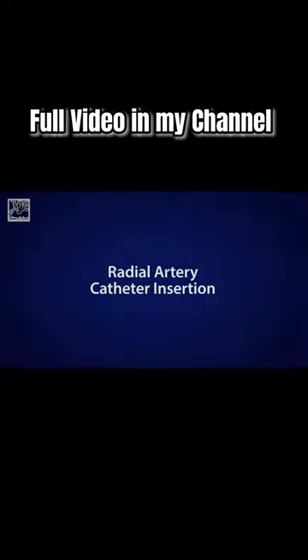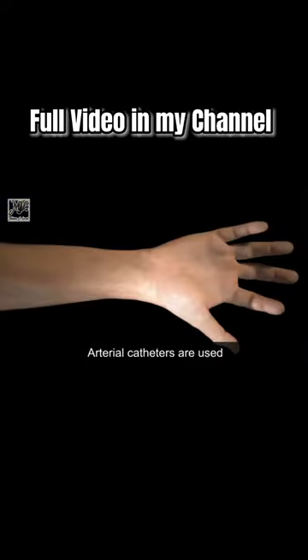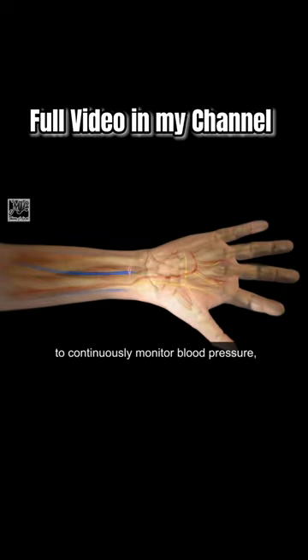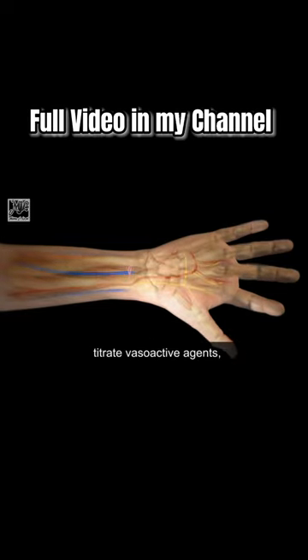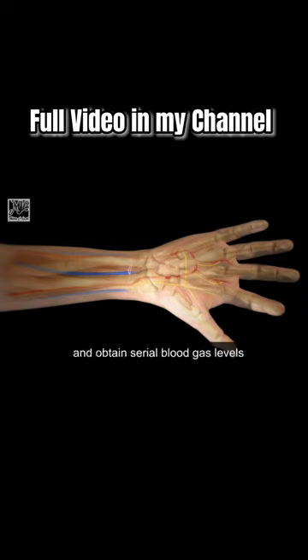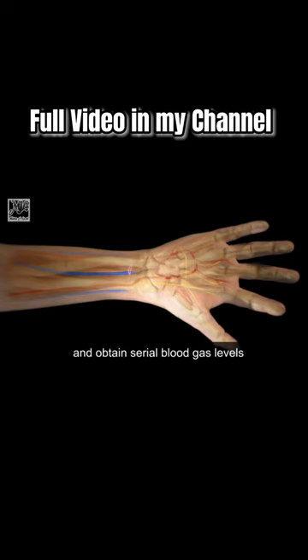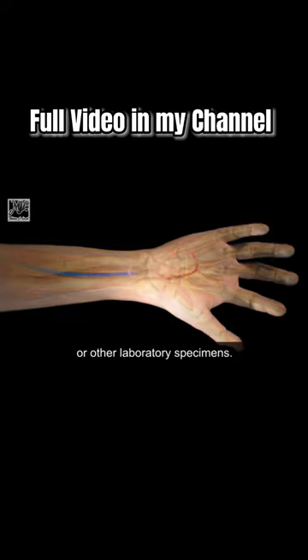Radial artery catheter insertion. Arterial catheters are used to continuously monitor blood pressure, titrate vasoactive agents, and obtain serial blood gas levels or other laboratory specimens.